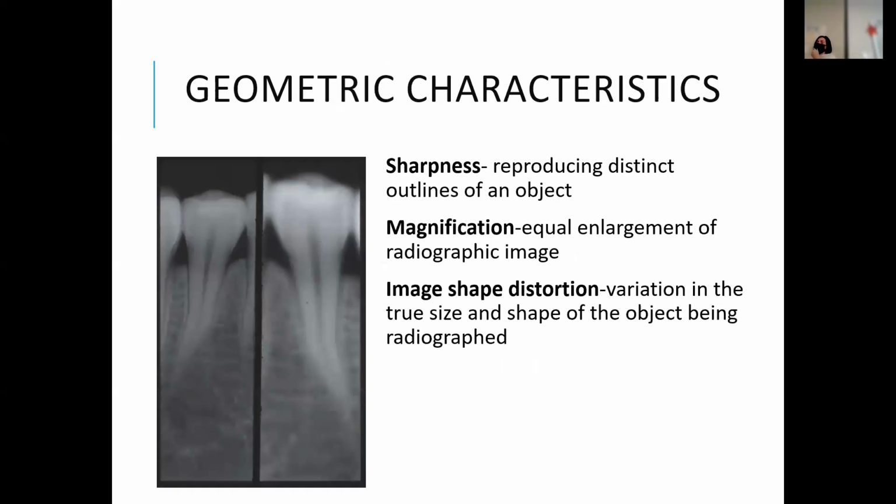Okay, so some other features when we're looking at our film are sharpness, magnification, and then the image distortion, whether the image is distorted or not. And there are some fun activities we'll do next week with a flashlight so that you can kind of see this. It doesn't work perfectly, but it gives you a really good look, some of them work better than others, I should say.